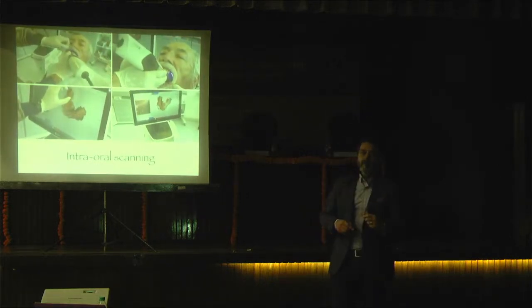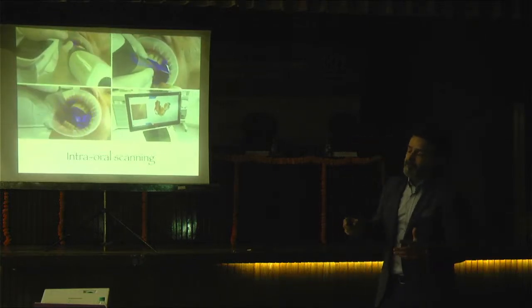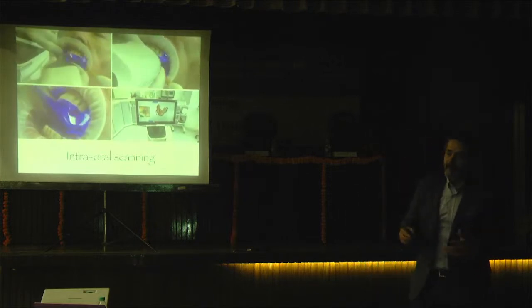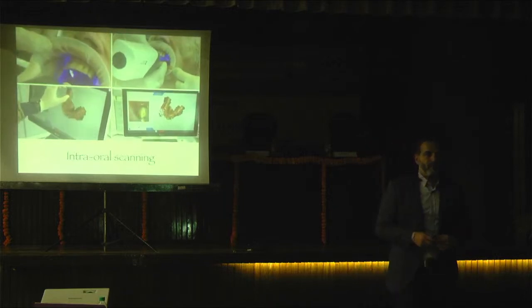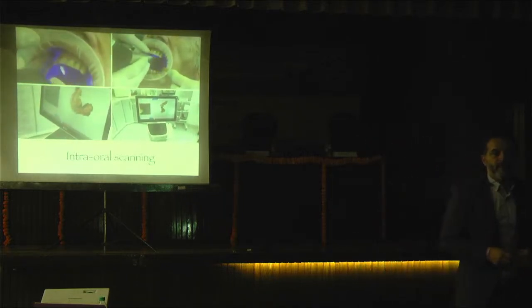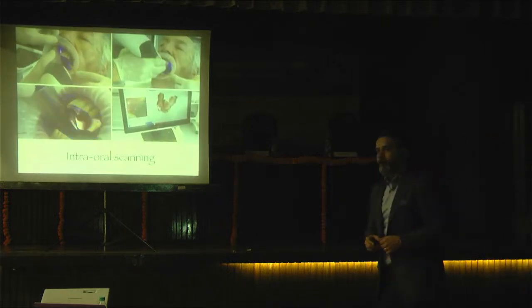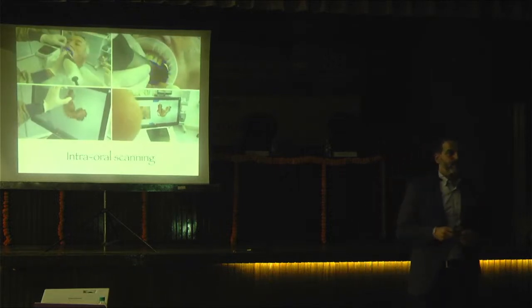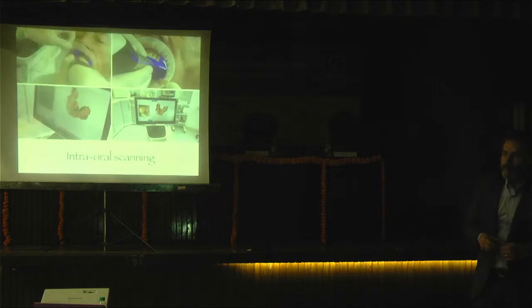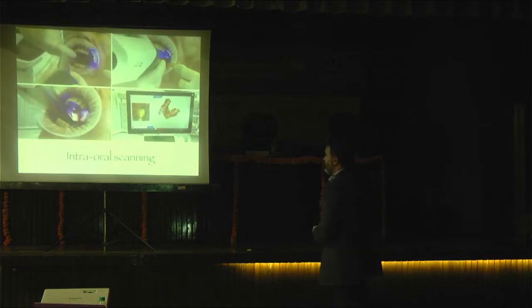So, intraoral scanning in my clinic, it is very easy to use the Dentsply Sirona product, which we call PrimeScan. I don't have PrimeScan, I have Omnicam, because I'm not so young. Six or seven years ago, there was no PrimeScan. But the PrimeScan has so many features. Why? Because you can make a very good scan on the edentulous side. So it is the most important difference from the Omnicam.